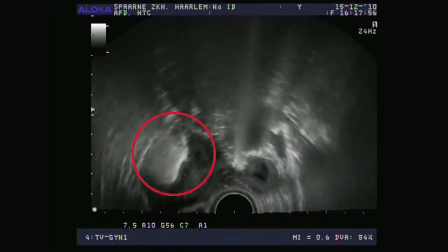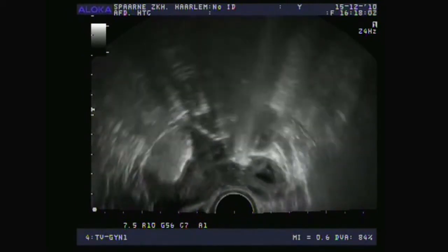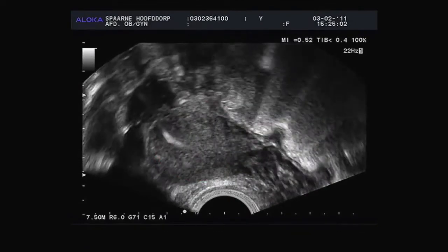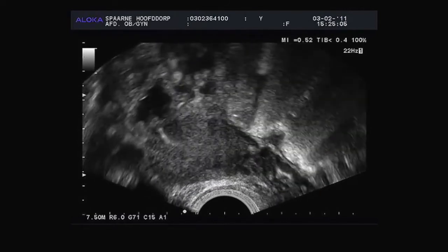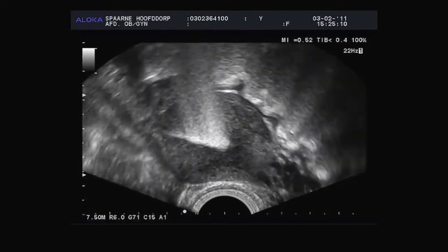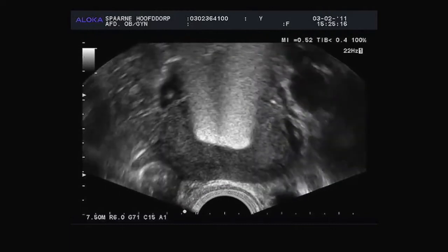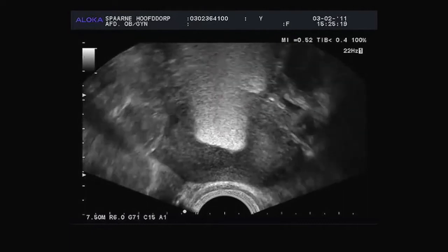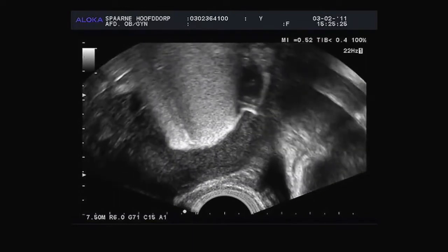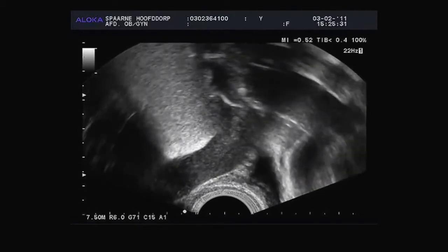And look here — here you can see that nice, long white line: the fallopian tube. I keep turning the tip to follow the foam. Here you can see the winding — it's so beautiful. The foam fills up to the fundus, and now we move a little bit to the side, from longitudinal to transversal, and then you can see the first fallopian tube come up immediately. There's a great deal of peristalsis, a lot of movement around it, which can sometimes make the ultrasound difficult. The fallopian tube turns with a sharp twist and then back again, straight as it comes back from the womb to continue behind the womb.